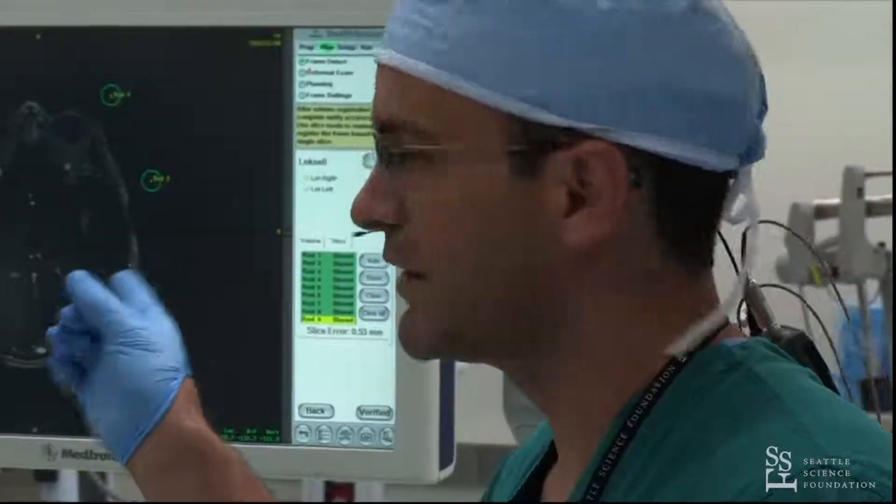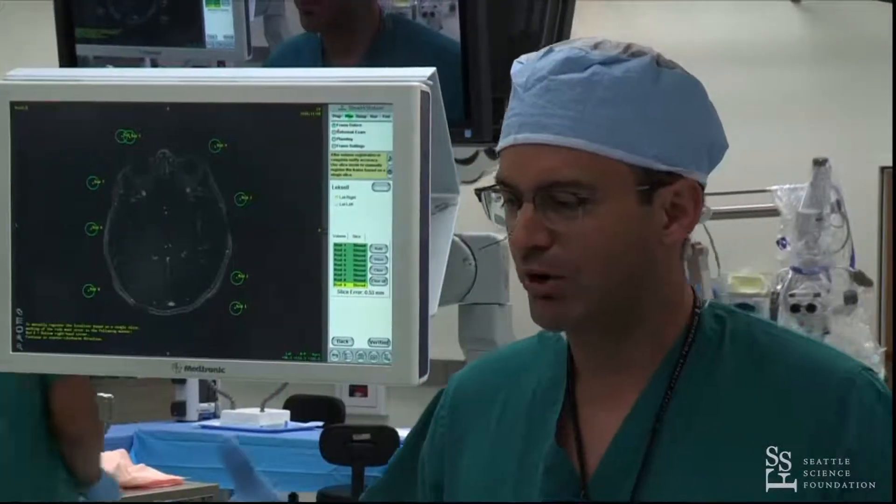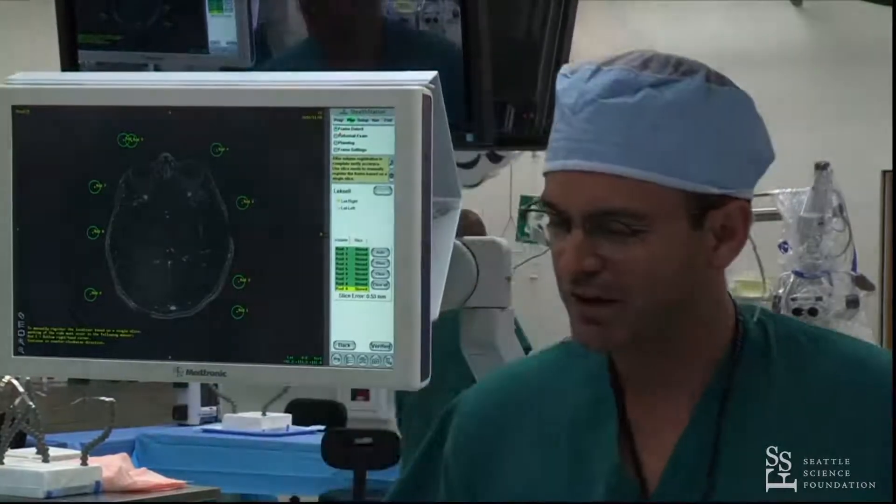We have the screens up here so you'll kind of see what we're doing. There are a few steps we'll skip, but more or less I'm going to try to do a start to finish.